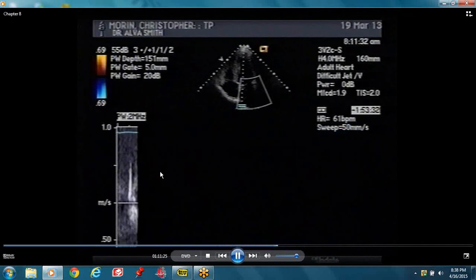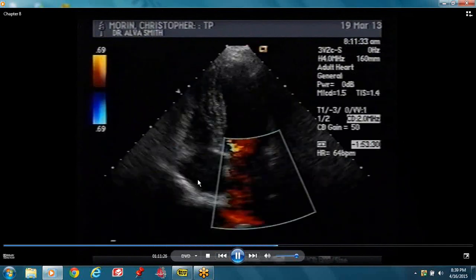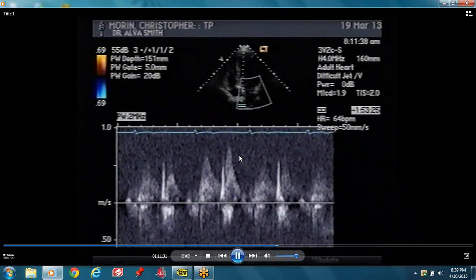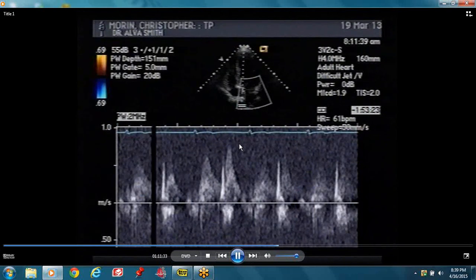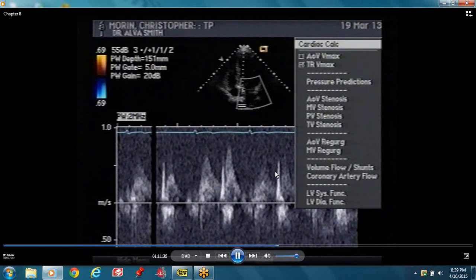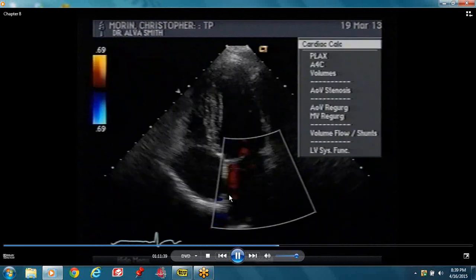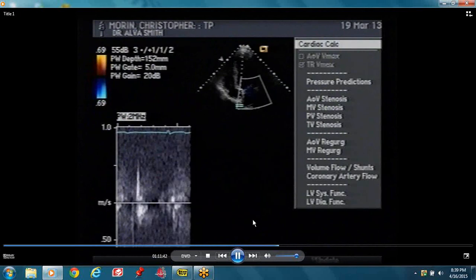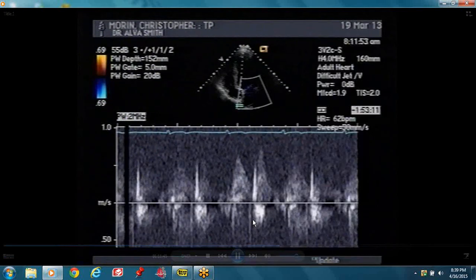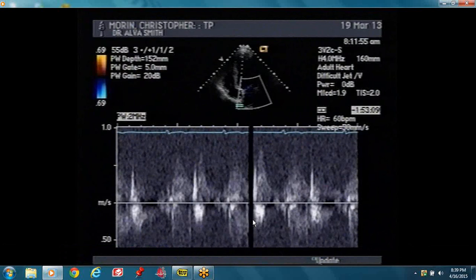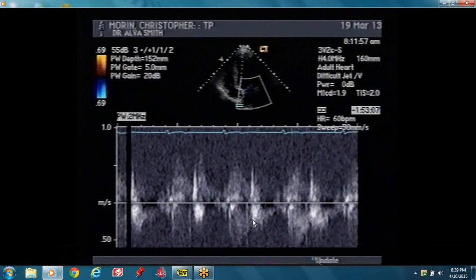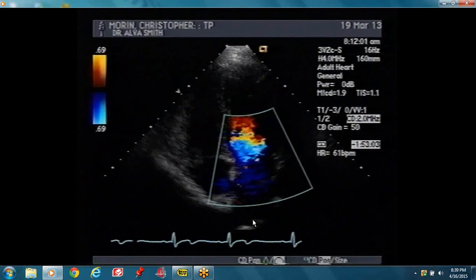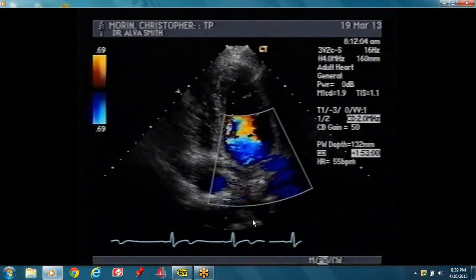You can see the pulmonary vein flow — systolic component, diastolic component. Always try and identify them. It's important to evaluate your pulmonary vein flow not only for diastolic function and dysfunction, but also if you want to determine the severity of mitral regurgitation.